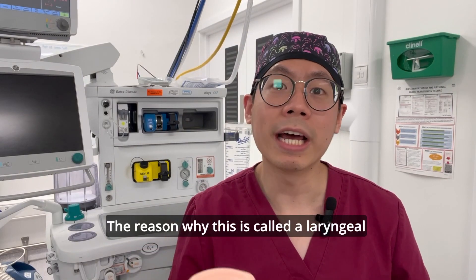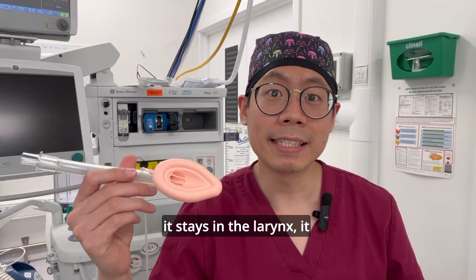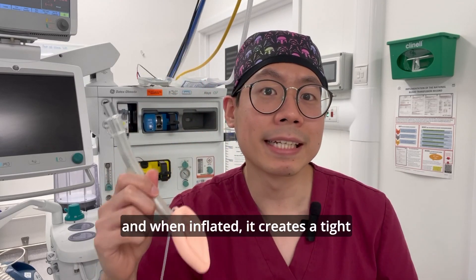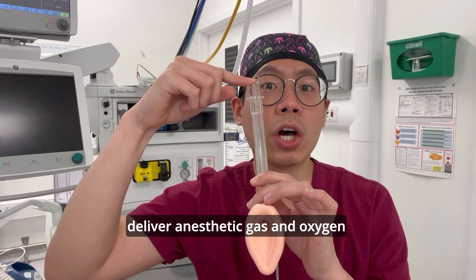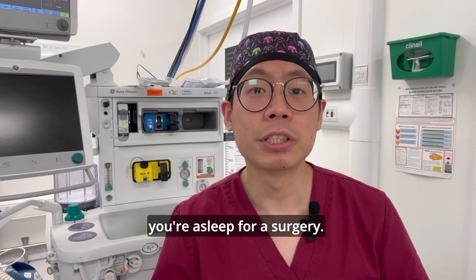The reason why this is called a laryngeal mask airway is that, as the term suggests, it stays in the larynx. It looks like a little mask, and when inflated it creates a tight seal around the area above your vocal cords, allowing us to deliver anesthetic gas and oxygen into your lungs whenever you are asleep for surgery.